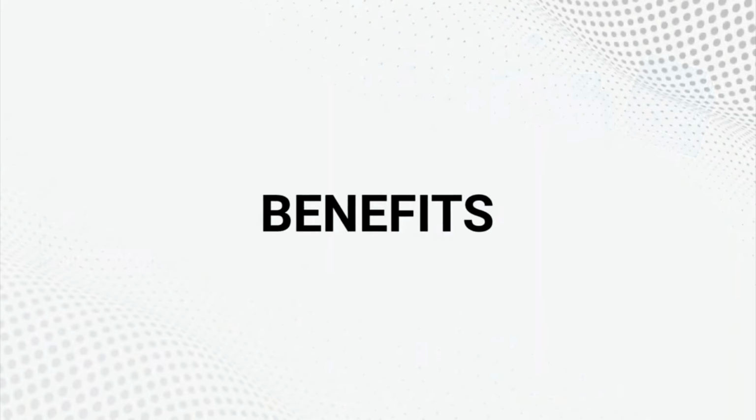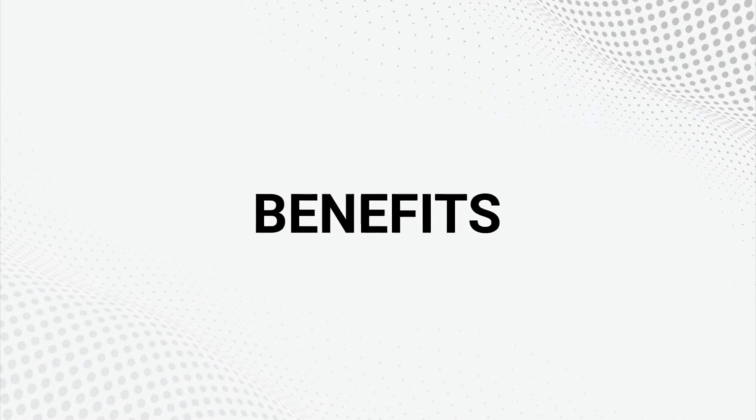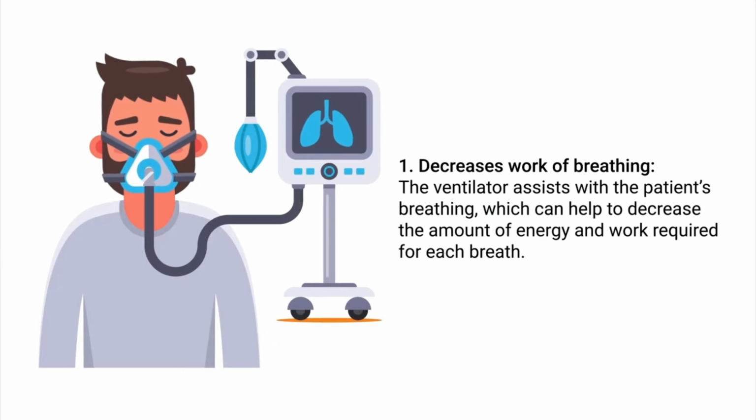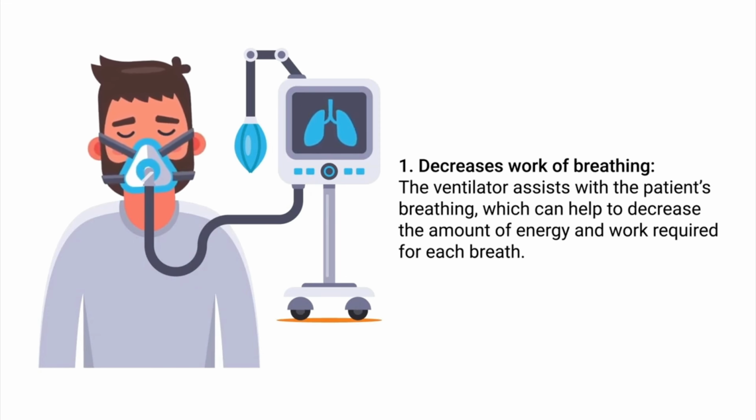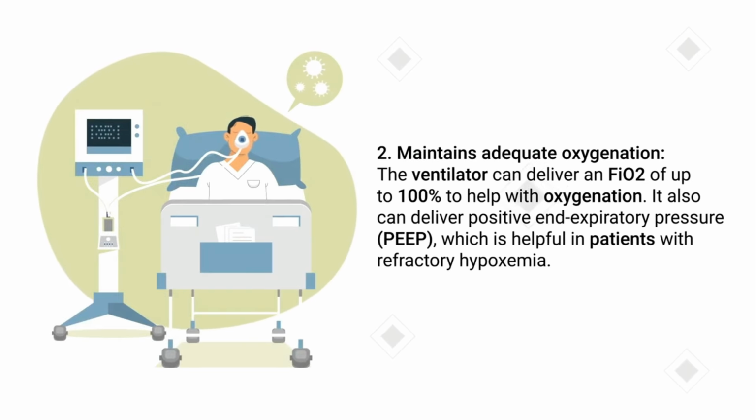Now let's talk about the benefits. There are many benefits for patients who are receiving mechanical ventilation, including the following. The first benefit is that it decreases work of breathing. The ventilator assists with the patient's breathing, which can help to decrease the amount of energy and work required for each breath.